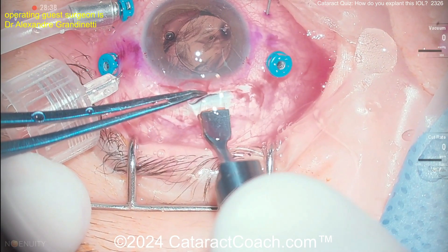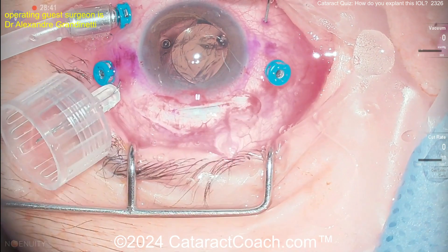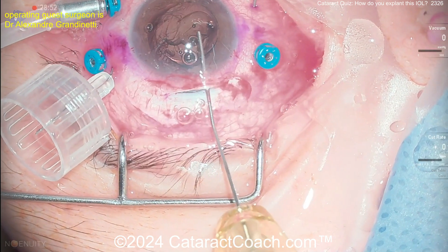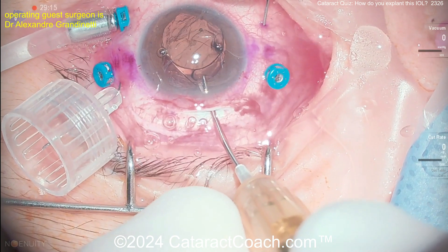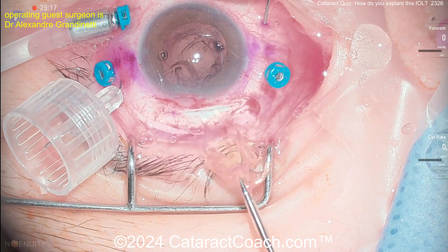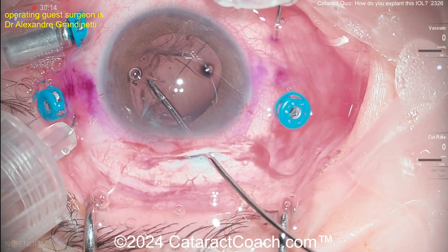Here's the vitrectomy, and here comes the scleral tunnel being enlarged with a diamond blade. You can see it's not at the cornea — it's a scleral incision. With the instruments going inside the eye, you can just grab that lens and pull it right out through the six-millimeter wide incision. That's the easy way.